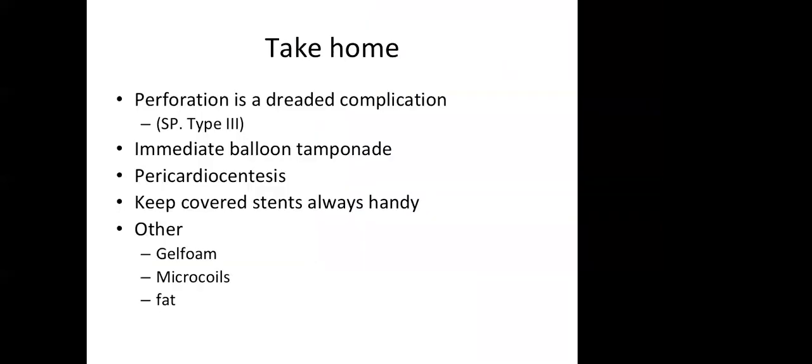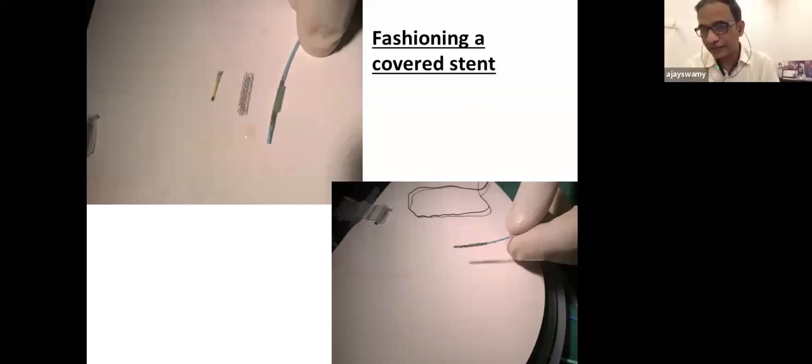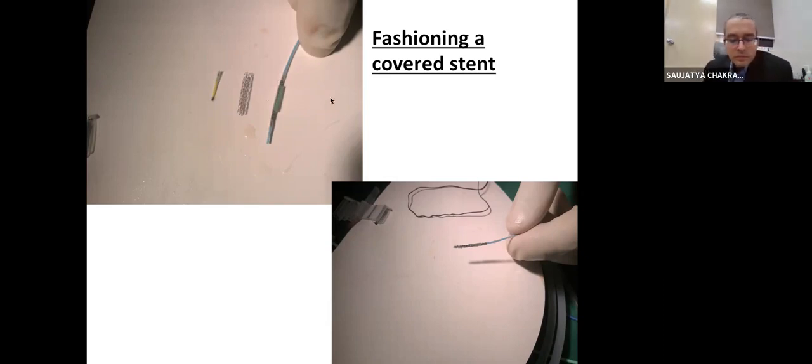So you need to repeat this a bit slowly. So you need for this two stents and one balloon. So one stent is left as it is. You choose the inner stent to be 1:1 with the size of the vessel you want to close. Then you choose a balloon which is 0.8 or 1:1 of the size of the vessel. And you inflate the balloon outside and you use a blade to slice off a sleeve of the balloon. Once the sleeve of the balloon is sliced off, that sleeve is now pushed onto this stent, left there.